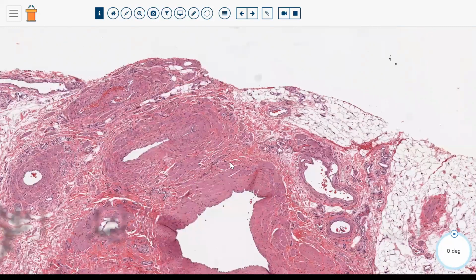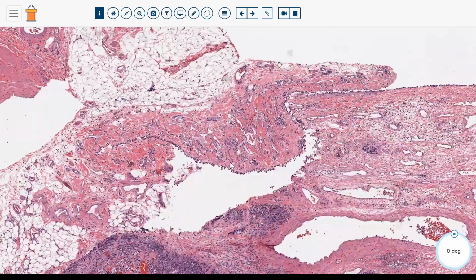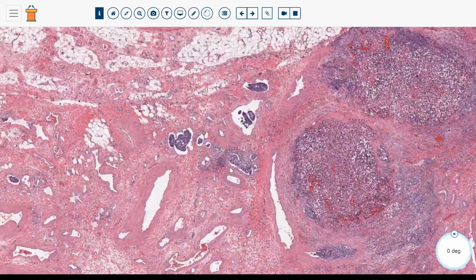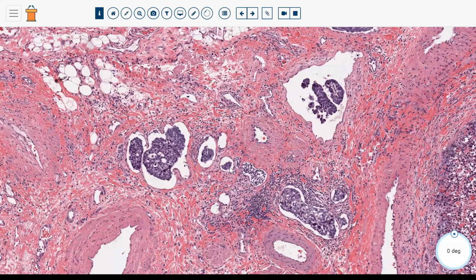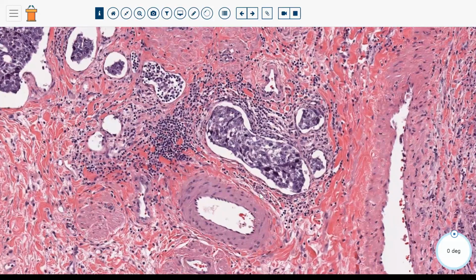But in this case, I don't see very much tumor that's spread onto the outer surfaces of the slide. So I think that gives even more support to interpreting these small foci as true lymphovascular invasion. And I think these would be very convincing even if we had a moderate amount of spread of tumor cells on the outside edges of the slide, just because these are nice cohesive clusters of cells that are conforming to the shape of the vascular space.